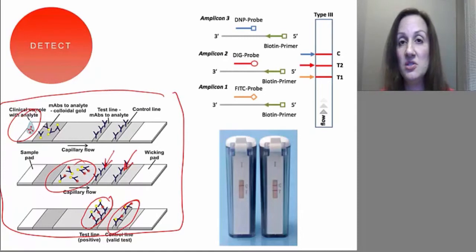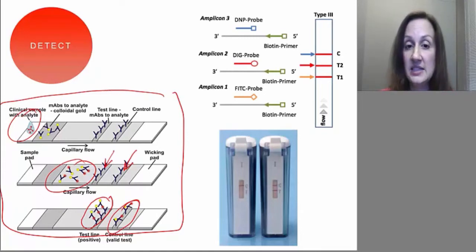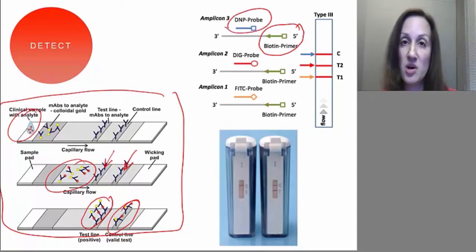It turns out that you can also use nucleic acid targets, properly tagged, to achieve this same objective. So if, when you're doing your HDA reaction, you include a primer that has a biotin attached to it, and a probe that has a small molecule dye or another small molecule attached to it, you can create these same test lines that have antibodies to your analyte, while you mix streptavidin-coated beads into the system, which will then cause them to aggregate on the different test lines to give you your red line output.